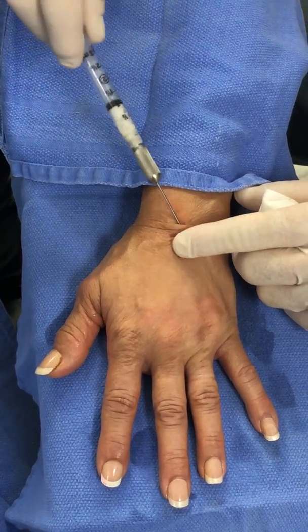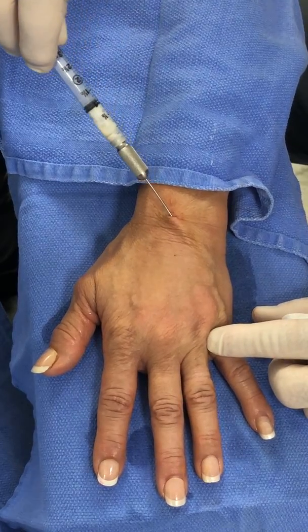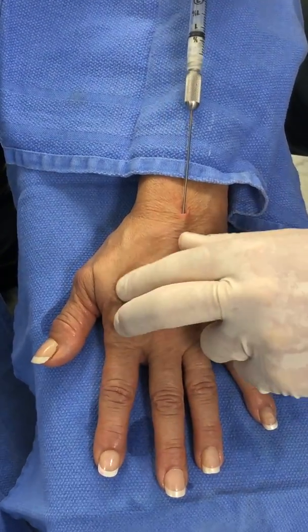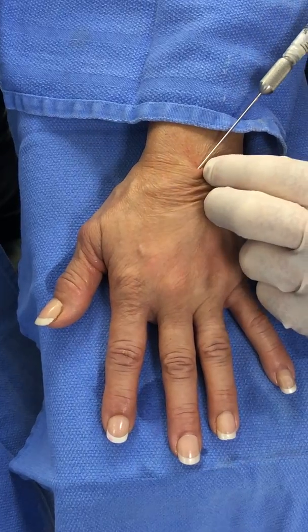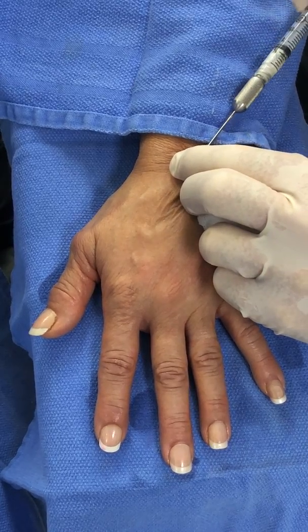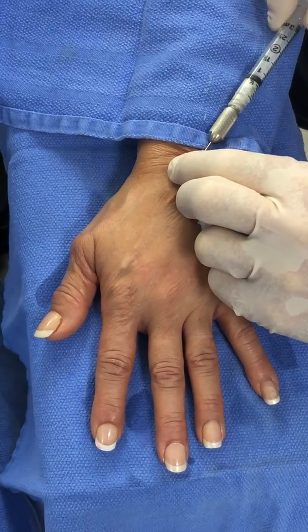I go ahead and get an extreme lateral on the border over here. I'm constantly massaging. My mixture contains a small amount of Marcaine xylocaine because I do not want the patient to have pain after injection.